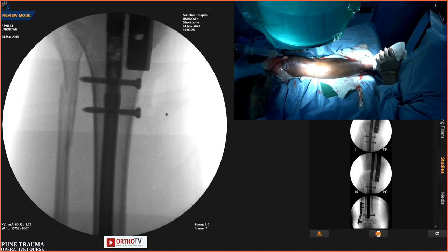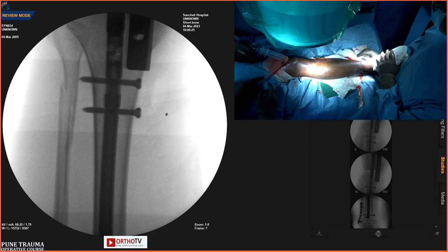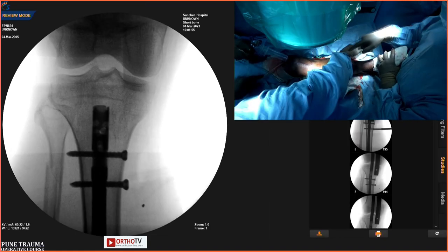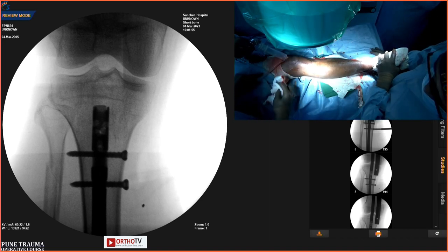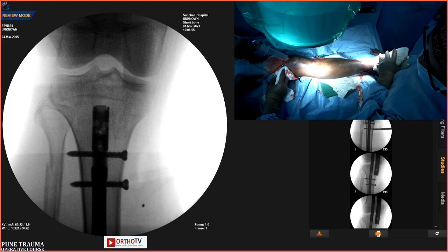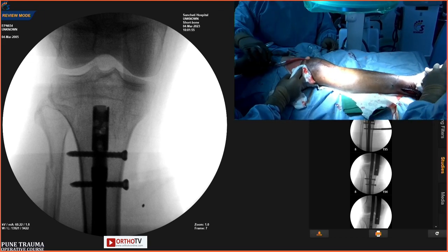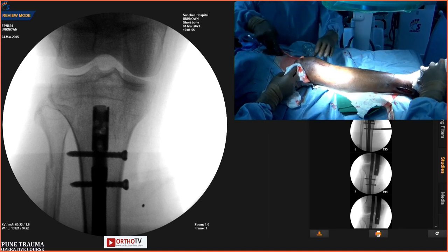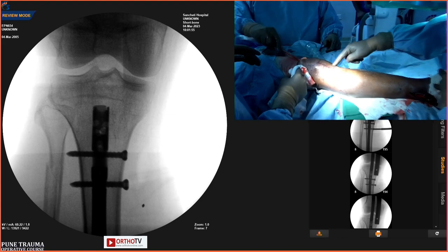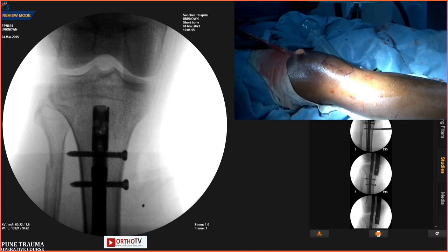Okay, so I have completed the distal locking and the proximal locking, and we are washing the joint now. See how Gadegone sir is giving a lavage inside the knee joint, which is, I think, of paramount importance to prevent the debris from accumulating. And now you see the alignment of the limb, and we will show you in a minute the entire tibia, from the top to the bottom, the AP view.